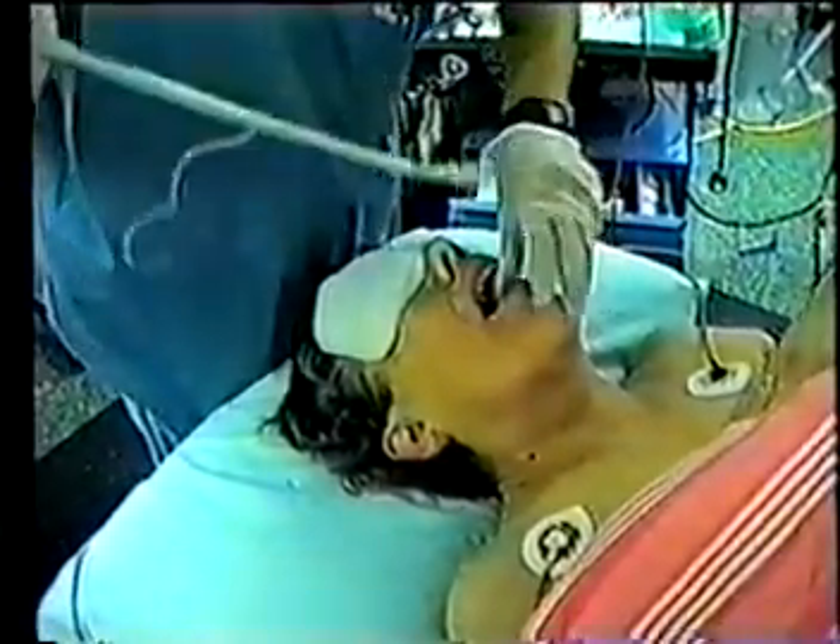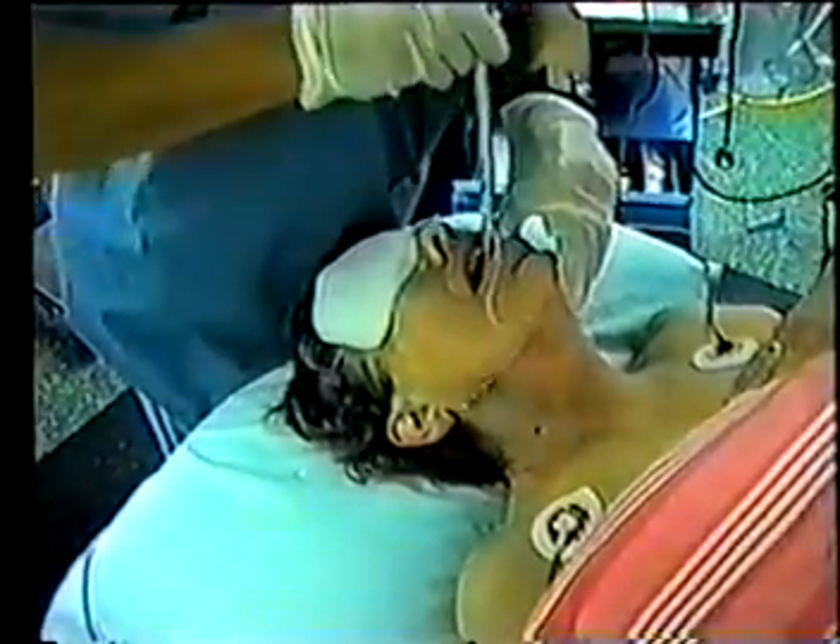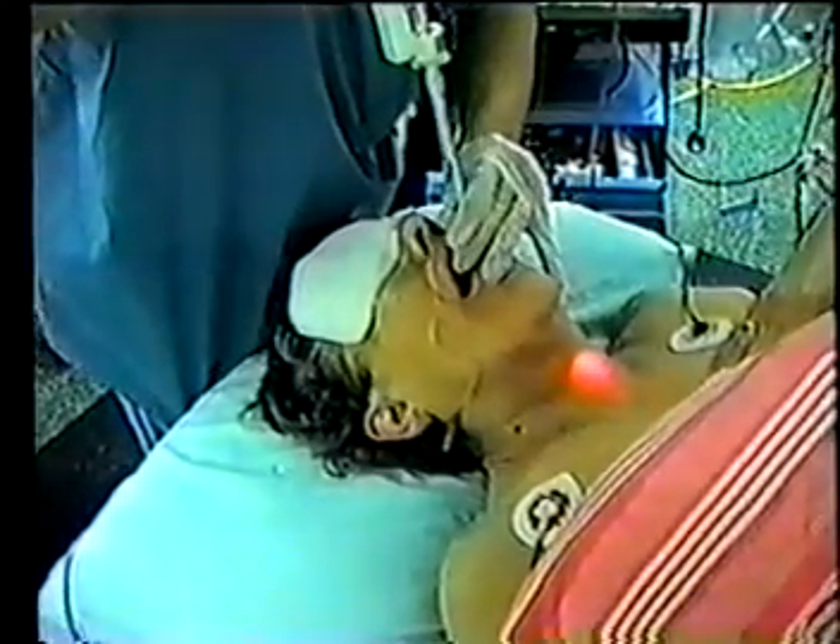The technique of light-guided intubation evolved from the knowledge that a very bright light placed at the end of an endotracheal tube can transilluminate the tissues of the upper airway. By observing the glow, the position of the tube tip can be monitored. Advancing the tube until the glow is seen to begin to disappear beneath the sternum reliably positions the tube midway between the cords and the carina.